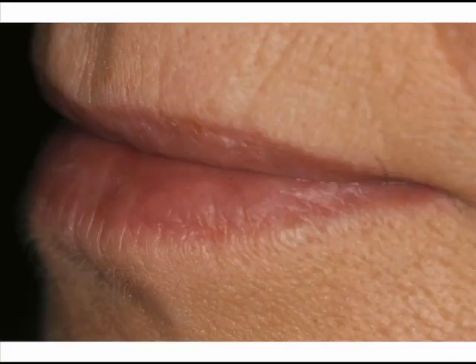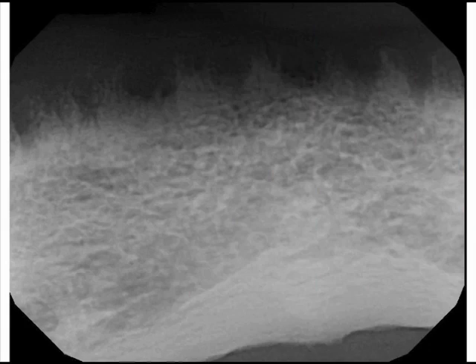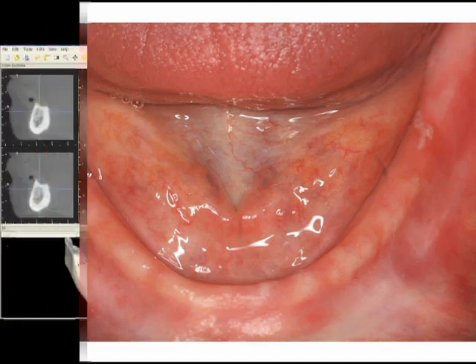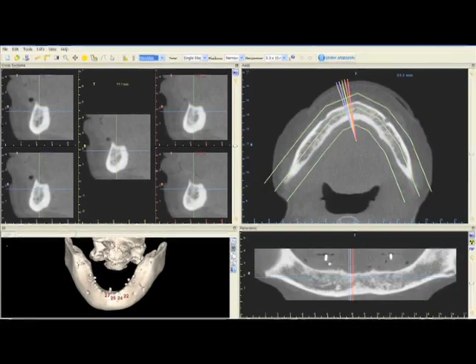Figures 5, 6, and 7 demonstrate proper lip position with a properly formed conventional denture. Figure 8 in this situation shows the preoperative bone morphology in a two-dimensional radiograph. Clinically, there appears to be a thin mandibular ridge. However, if we do take a CT scan or a three-dimensional image, we can see that there is indeed enough cortical width of bone, anatomic width, and height of bone to possibly place some dental implants.